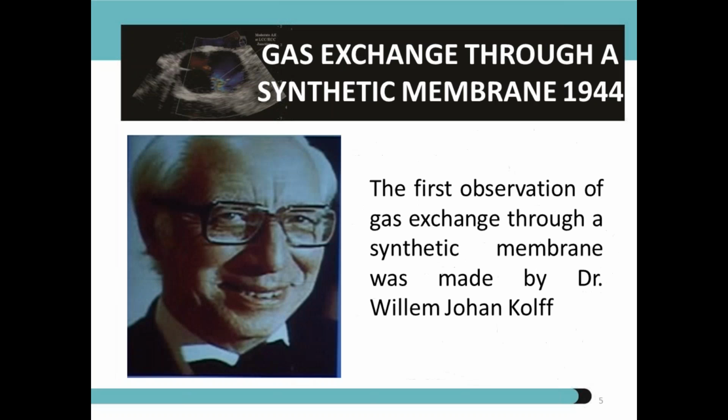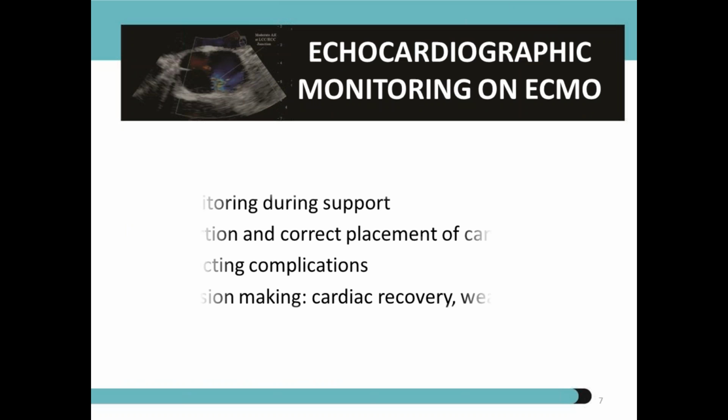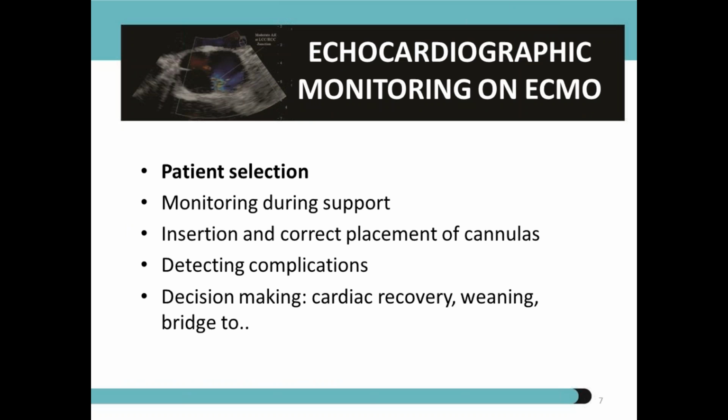So while we were doing this, the concept of echo and ECMO came, and we know arterial ECMO circuits and we know venous. I won't go into this. Dr. Bartlett is the father of ECMO. You've been hearing that. But we started echo and ECMO for 5 major reasons.